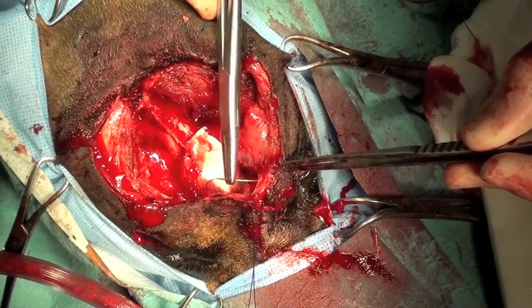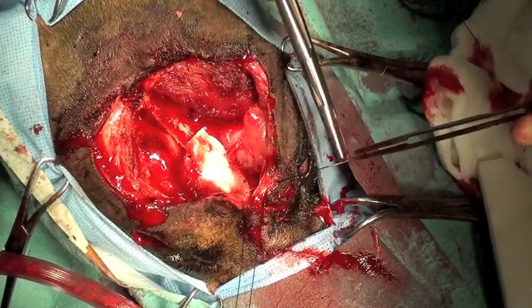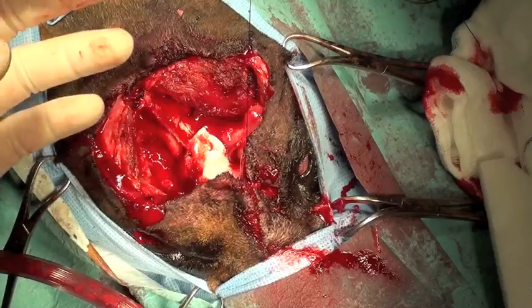Hemostatic foam is used to try to slow down some of the hemorrhage that we were getting from the exposed surface of the brain.